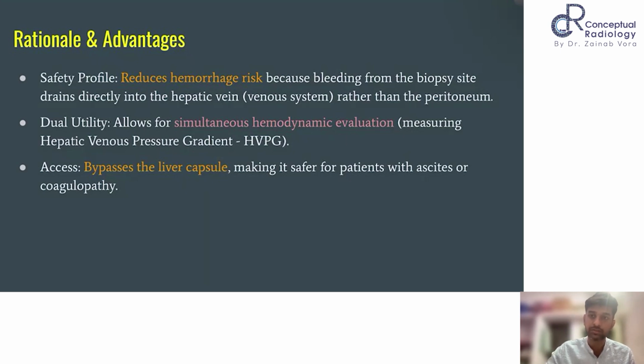If you see, there are causes of portal hypertension. Majority of portal hypertension is caused due to pathologies involving the sinusoidal and post-sinusoidal regions. So HVPG plays a very important role, although it's an indirect measure of portal vein pressure. It is the most commonly done procedure. We don't do a direct portal venous pressure measurement, which is very rarely done. So the most commonly done test to measure the portal vein pressure is measuring the HVPG. We'll be seeing how it is done in the coming slides.